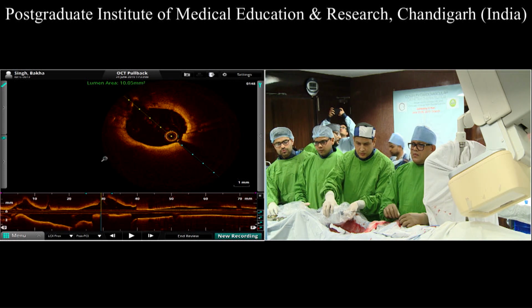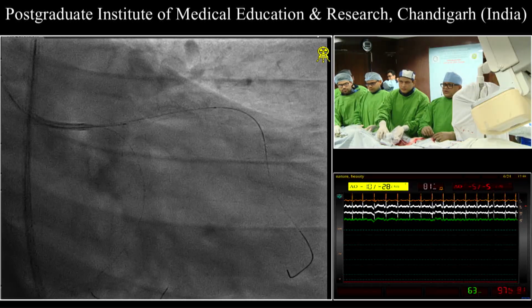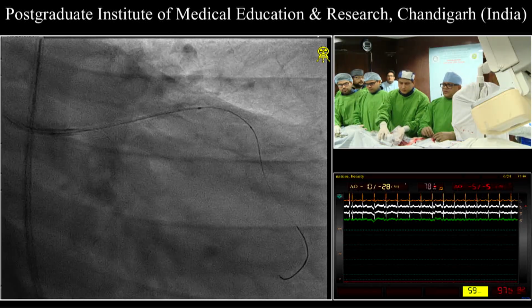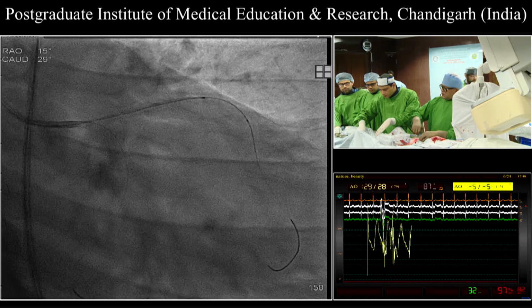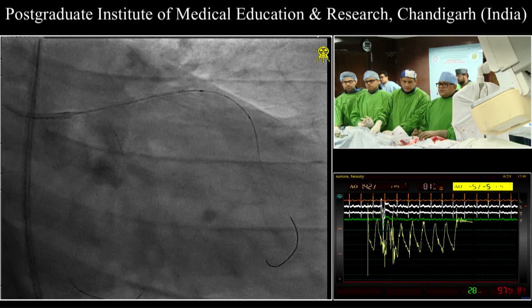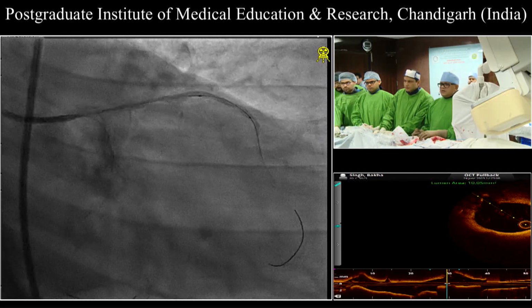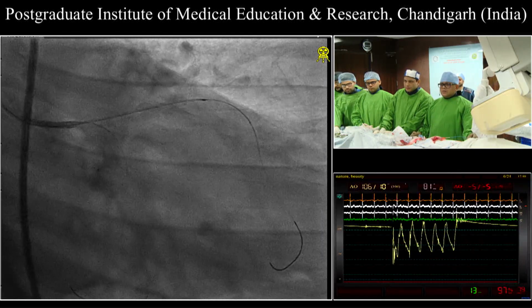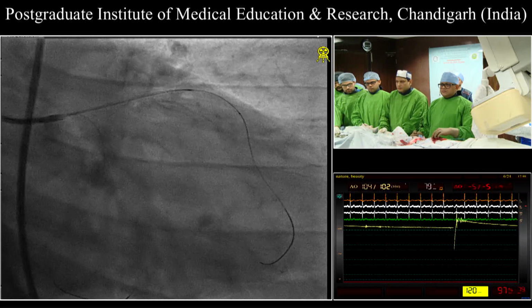Why do you think it's so important to do both runs? Now we are across the LAD. At this time we are informed about the plaque composition.